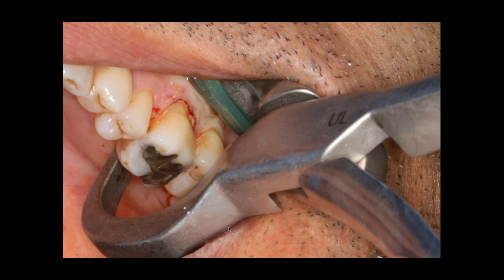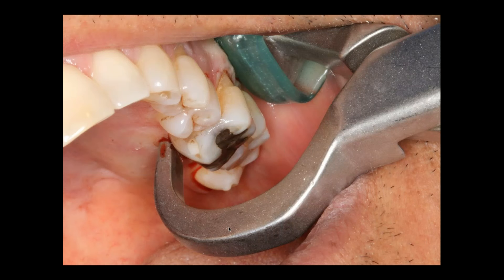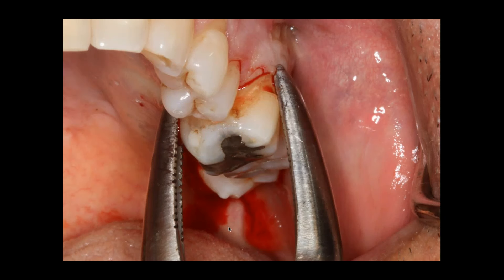The bumper is high up the vestibule. You can see I am not sectioning this tooth whatsoever. I'm simply rotating my wrist towards the corner of the eye. I am not squeezing — I'm actually putting a little tension with my forefinger and elevating up. And that tooth is going to, in about a minute, luxate up and out of the socket. You can see how it's lifting up and out. The instrument is not intended to remove the tooth in total; rather it's intended to luxate the tooth.